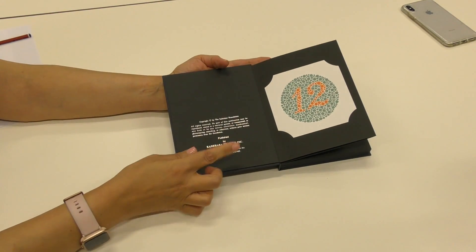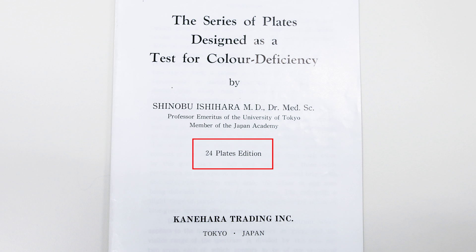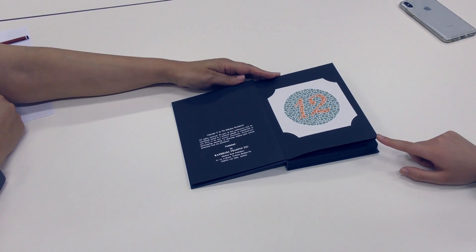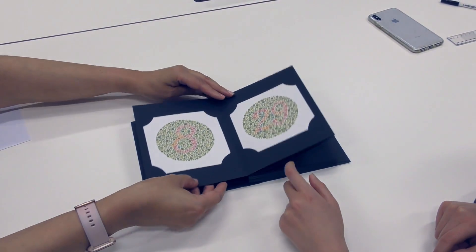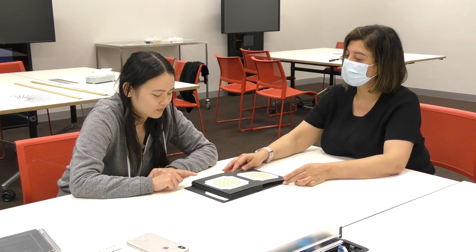Now let's have a look at how to use the test. This version of the test that we're using is the 24-plate version, though there are other versions out there. The subject is shown plates 1 through to 17, and if any mistakes are made, then the differentiation plates — plates 18 through to 24 — are used in order to try to tease out what type of colorblindness the subject has.